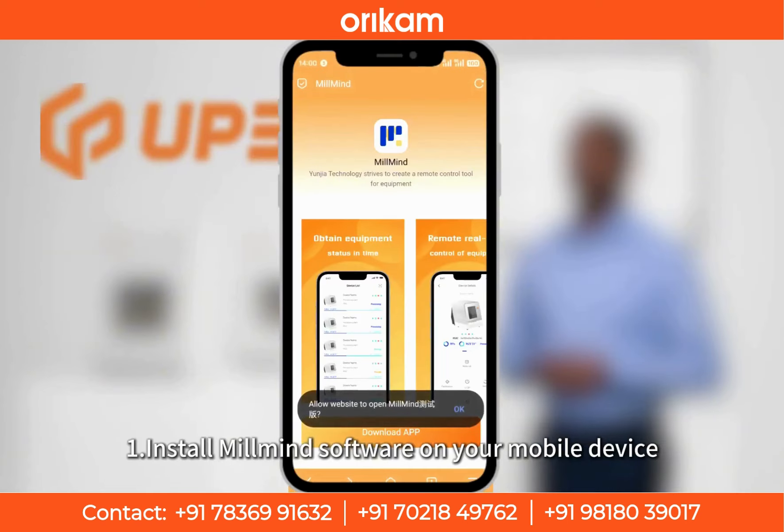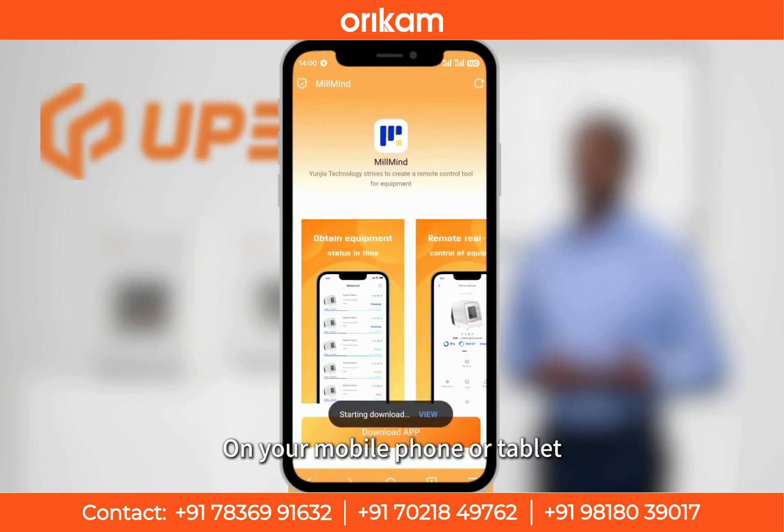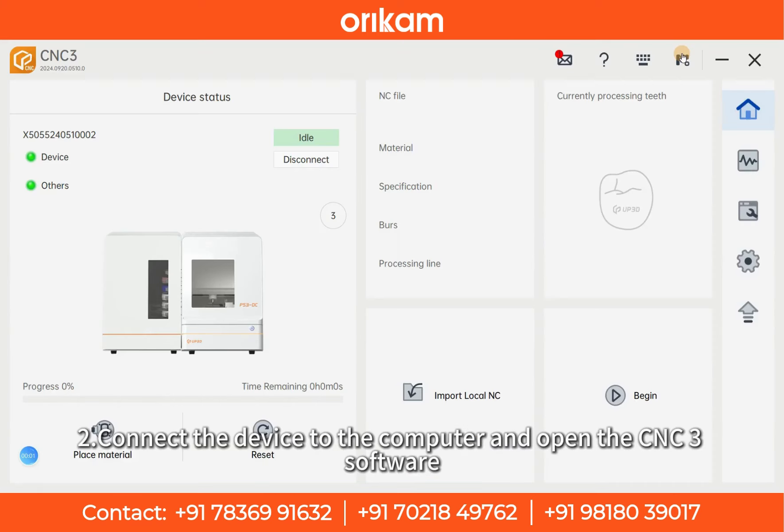Step 1: Install MillMind software on your mobile device. On your mobile phone or tablet, download and install MillMind software, which is the key tool for remote control.